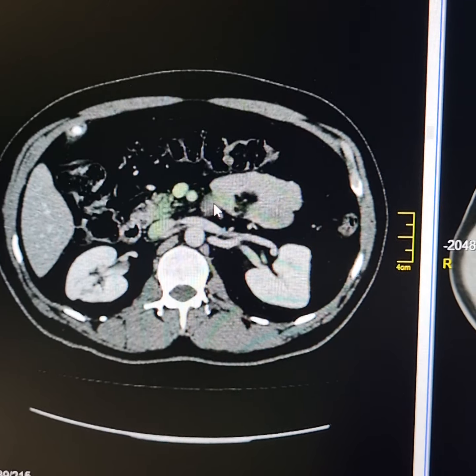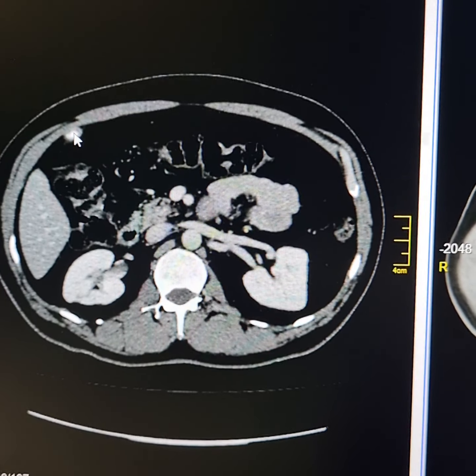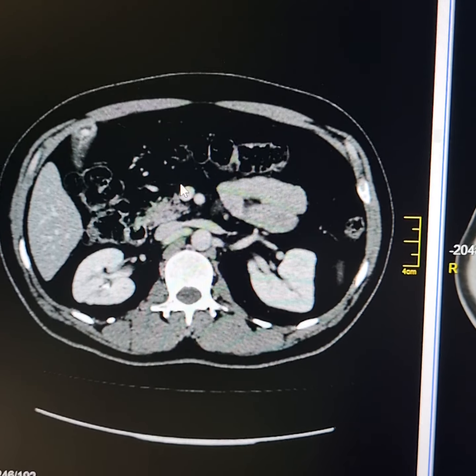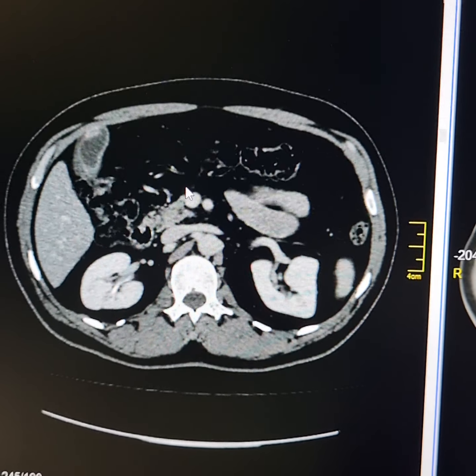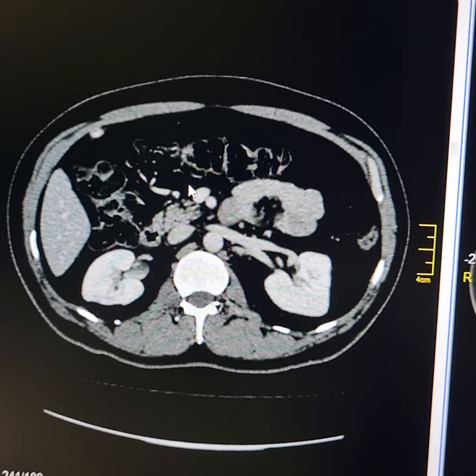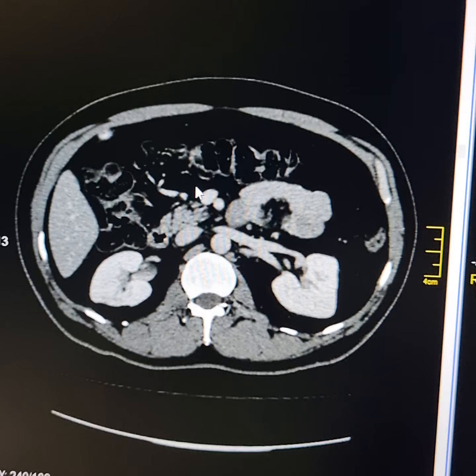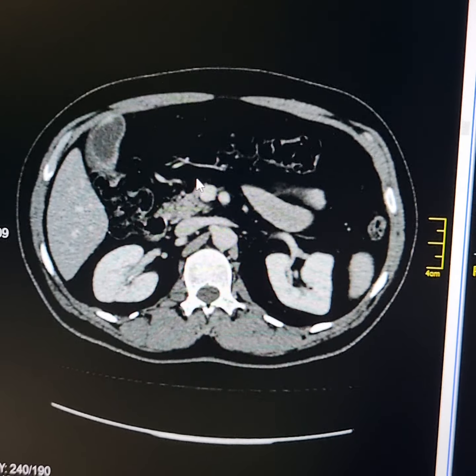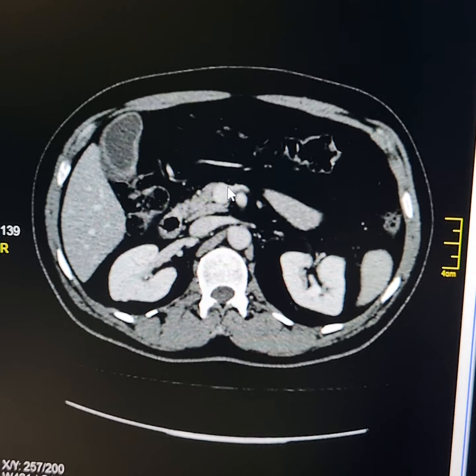So one has to be very, very careful in looking at this region of the gallbladder. We must do scans in the longitudinal plane as well as in the transverse scan. And please go beyond the lower margin of the gallbladder. The patient is preferably seen in supine position and in right anterior oblique. That means that the right side of the patient is slightly elevated.